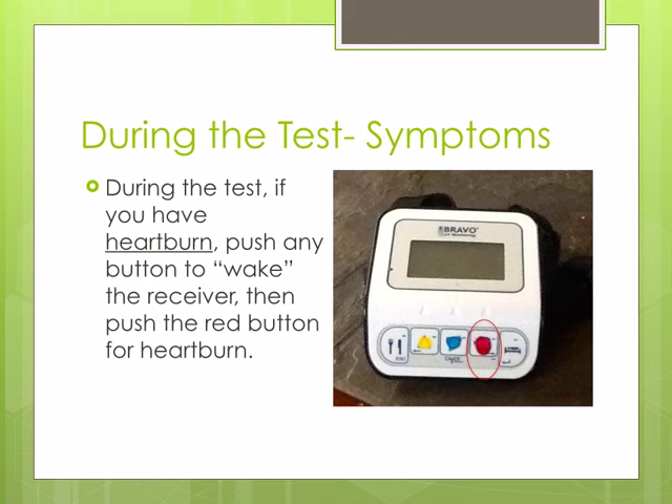To record symptoms of heartburn during the study, push any button on the receiver to wake it up. Then push the red button to indicate heartburn.